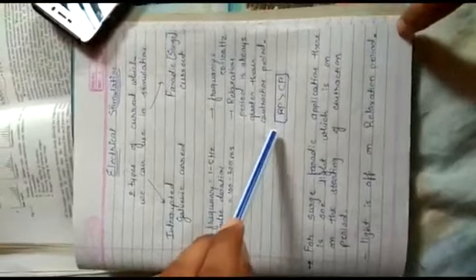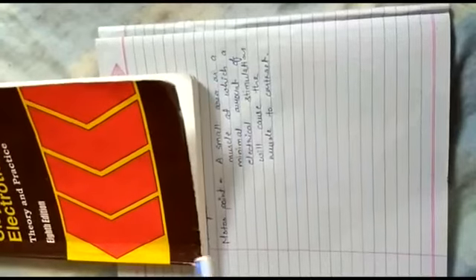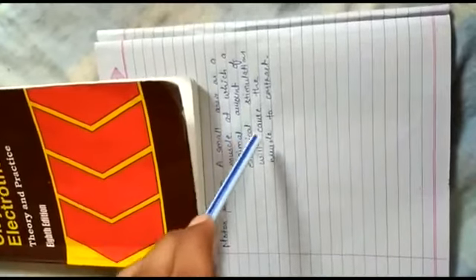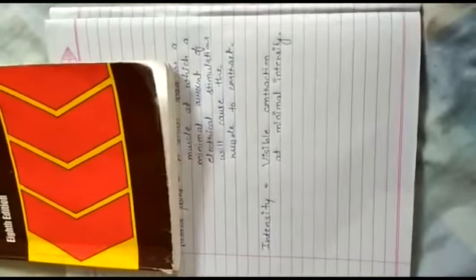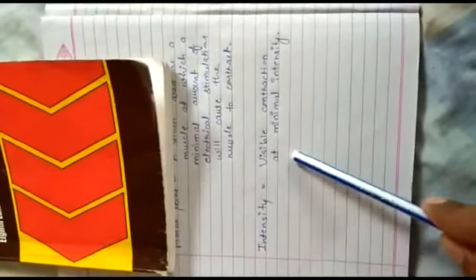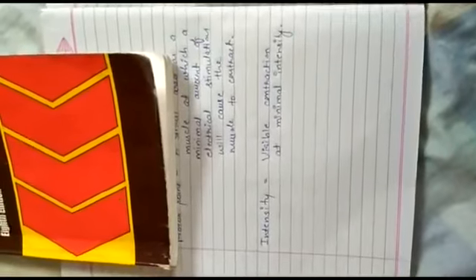What is a motor point? We can say it is a small area on a muscle at which a minimal amount of electrical stimulation will cause the muscle to contract, so we can see a visible contraction. How much intensity can we set in electrical nerve stimulation? There is a visible contraction at minimal intensity, so we do not set much intensity.